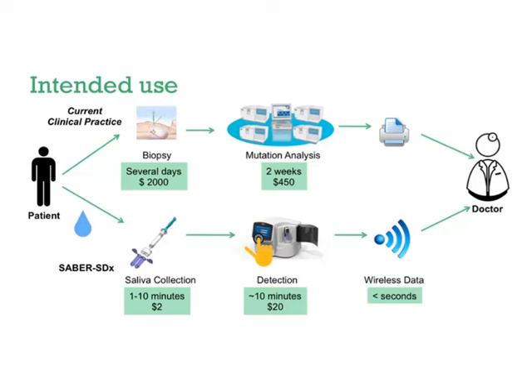And again, in summary, what we envision is that if a patient, in this case with non-small cell lung carcinoma, has actionable mutations in the parental tumor in EGFR, EFIRM liquid biopsy will detect these mutations in either plasma or saliva with close to perfect concordancy with tissue-based genotyping, using 40 microliters of a biological sample, no processing necessary, and the ability to obtain this information at the point of care or in a reference lab setting in a very short period of time, 10 minutes. So on that, I'll stop. Thank you.